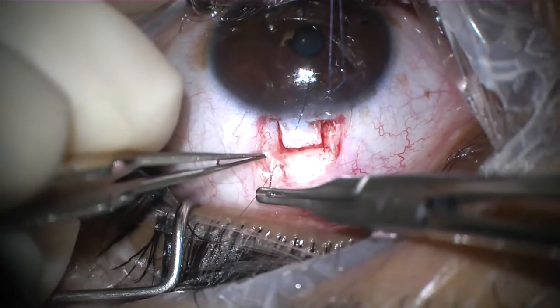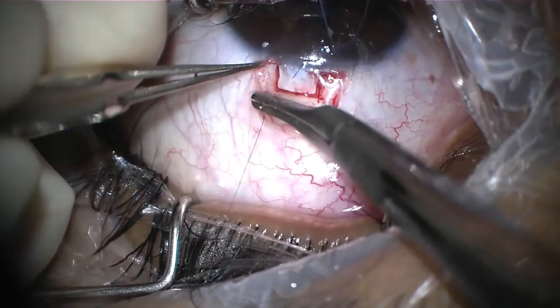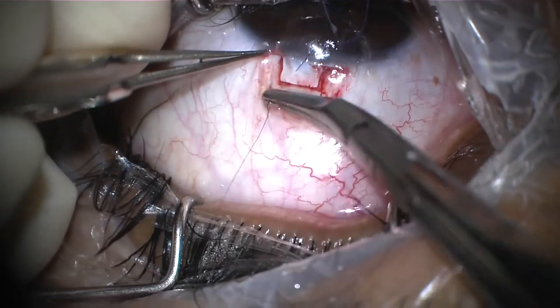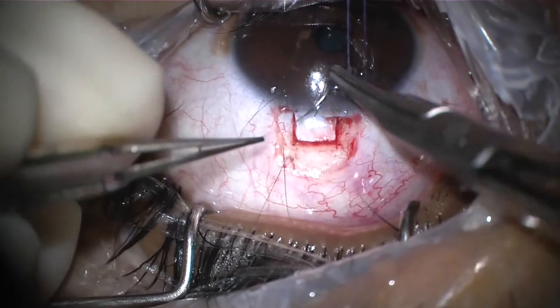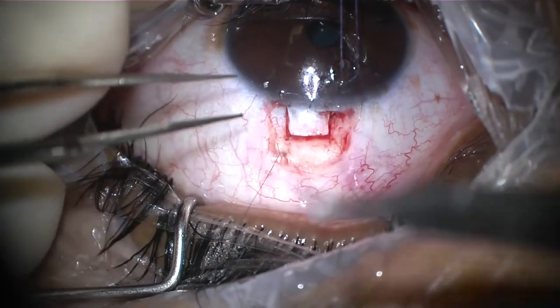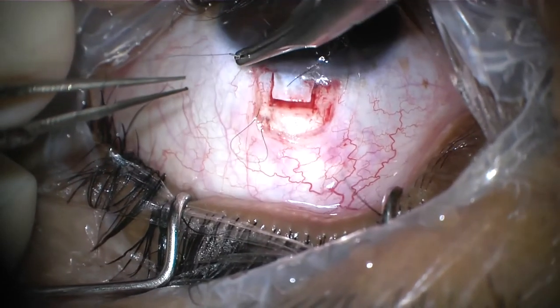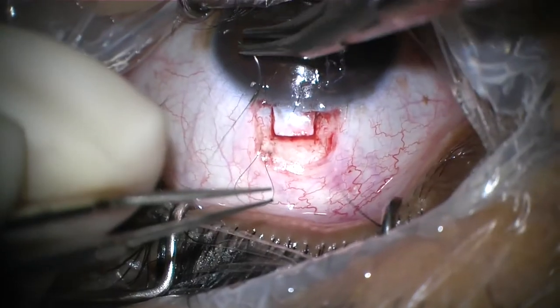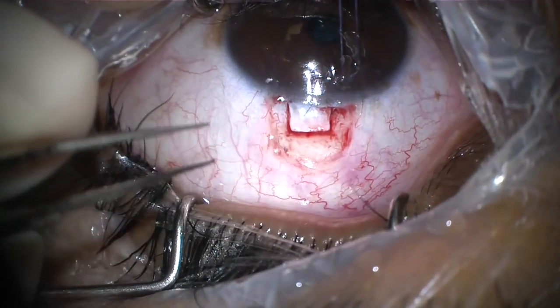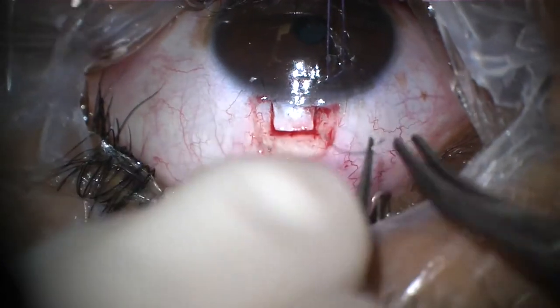After passing through the flap at the sclera, the needle is inserted along the arm of our scleral flap into the clear cornea, so we will have a loop on the sclera. Then the second pass goes through the cornea to the side, and we will have another loop on the cornea. Post-operatively, if we insert a needle under this corneal loop, the corneal end will come out and we can pull the suture out.